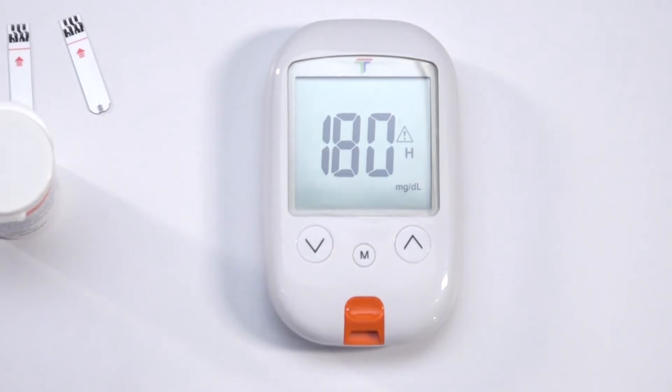Finally, we are on to the alerts for high or low blood sugar levels, values that are selected in consultation with your physician. To start the setup, press M.